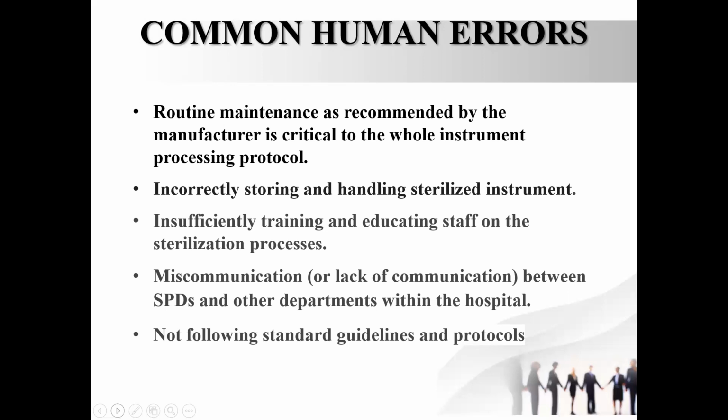That is also called sterilization failure. Okay, I already said this, but I'm going to say it again: insufficiently training and educating staff on the sterilization process. Process means washing, packing, sterilization, and issue. Train, train, and train again. Then miscommunication between the sterile processing department and other departments in the hospital, and not following standard guidelines and protocols.